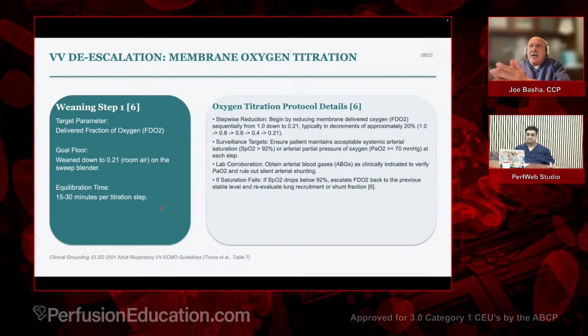If you come down from 100 to 80%, and your SpO2 goes from 100% to 99%, well, that's a good sign. And then you can kind of sit there for an hour or two and say, okay, well, I'm at 80%. Let me see what happens if I go to 75. You go to 75, you don't see any change, and then you go to 70, and maybe it does change a little bit. If it drops down all of a sudden to 96%, or 94%, you're still above 92. But I would stop weaning at that point.